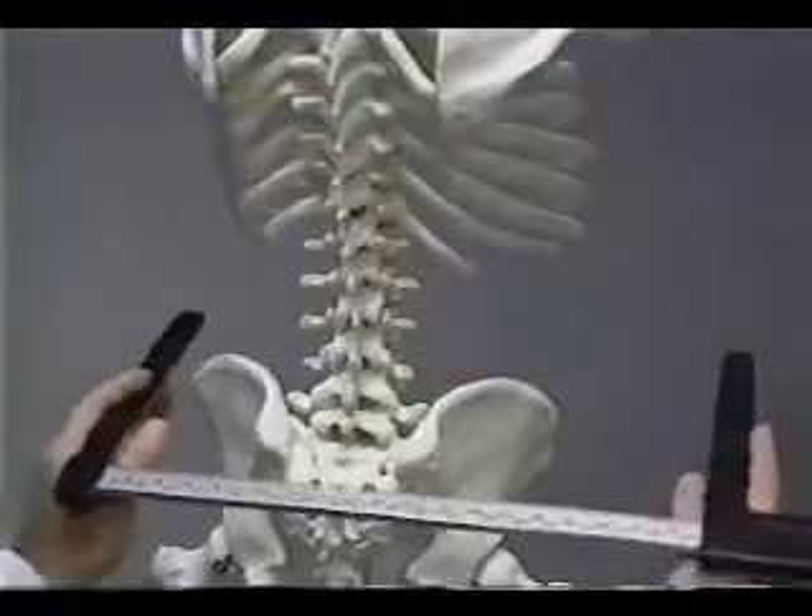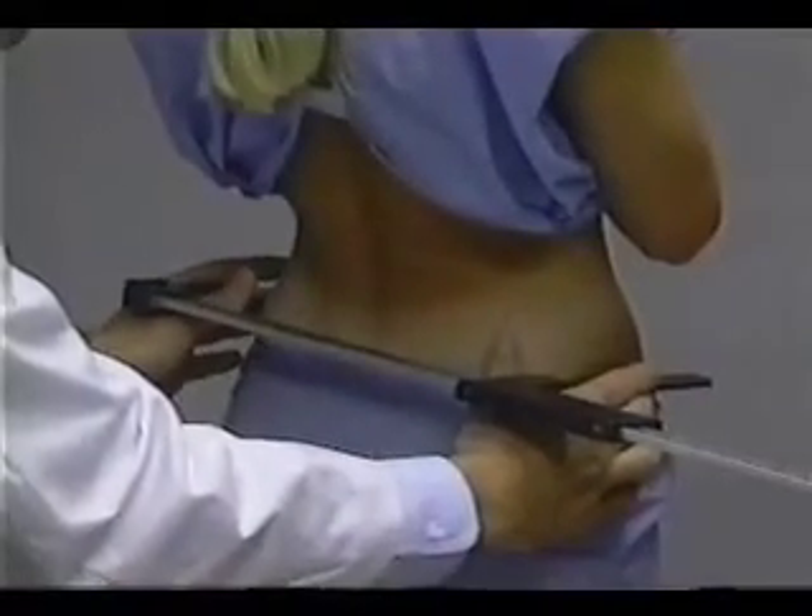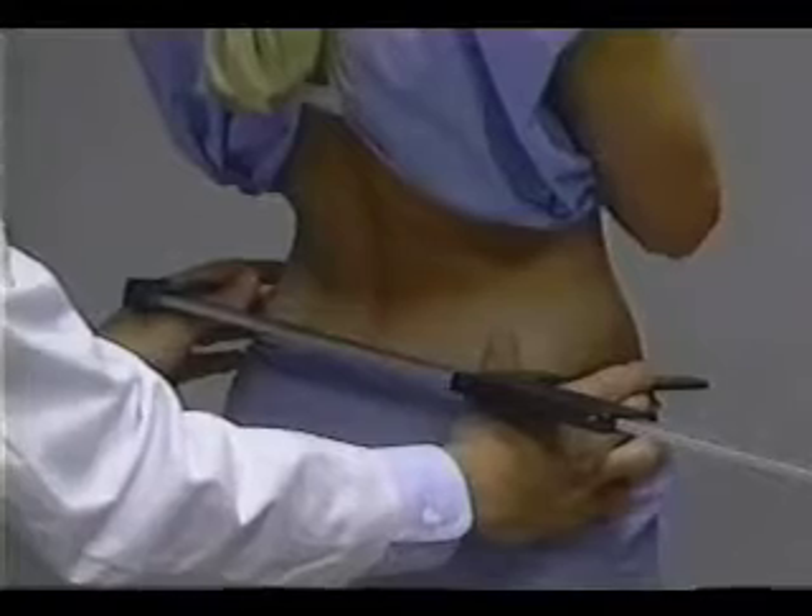The arms of the sliding caliper are placed on the lateral borders of the ilium and the soft tissue is compressed firmly. The maximum breadth is measured to the nearest millimeter.